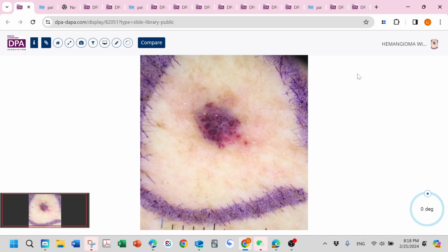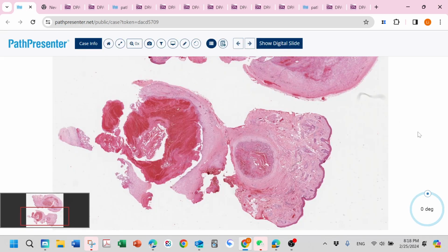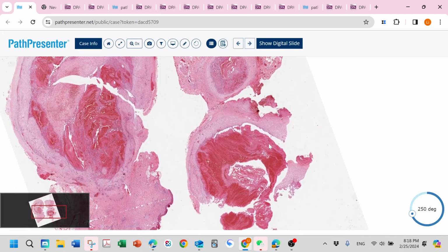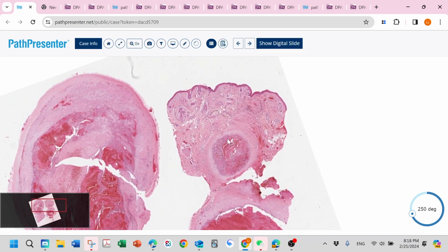This one is Masson tumor, aka papillary endothelial hyperplasia. This is another reactive lesion, and in this dermoscopy, we can see this vascular lesion, tons of dilated big vessels with thrombi. Actually, this is a truly reactive hemangioma. We even have a name, Masson tumor.